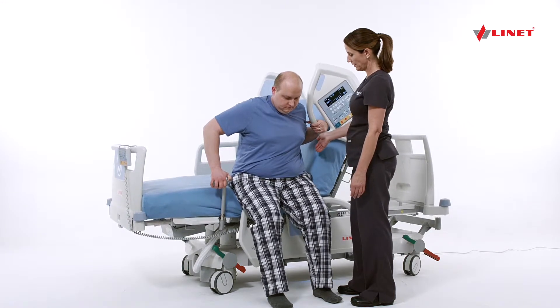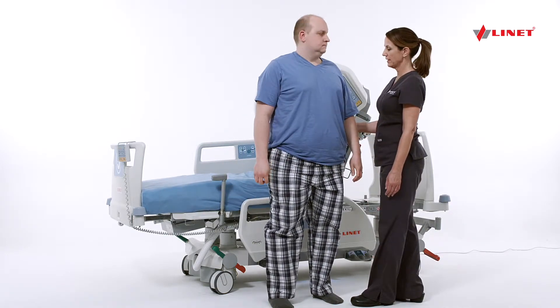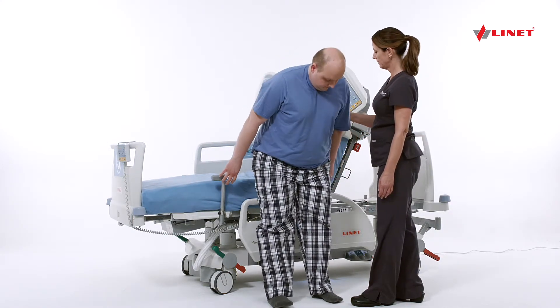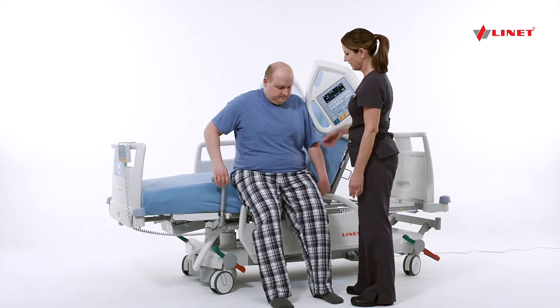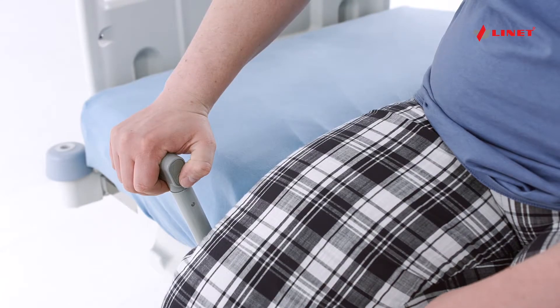The patient can adjust the height of the bed using the button on the side of the mobile lift device, or the caregiver can stand the patient up by pressing the bed high button on the iBoard panel. You may reverse the procedure to help the patient get back into the bed.